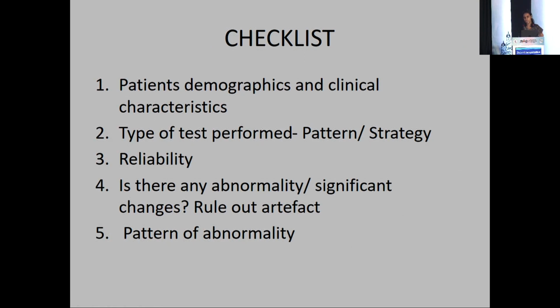So this is a quick checklist to look into the field before diagnosing glaucoma. Look at the patient demographics and clinical picture of the patient. What is the type of test performed? Is the field reliable? Look for any abnormality. Is it really significant? Rule out the chances of artifact. Look for any specific pattern of abnormality you see.